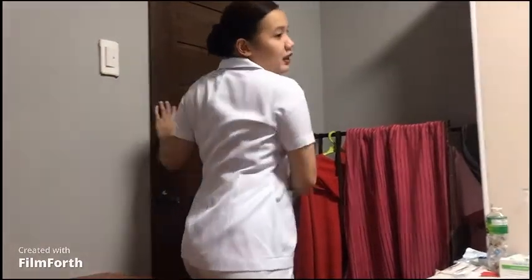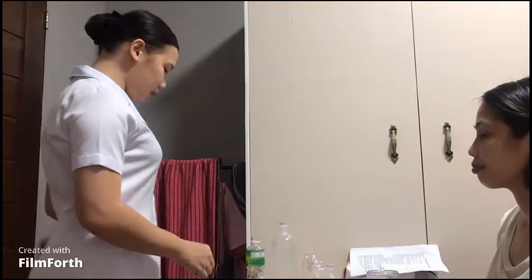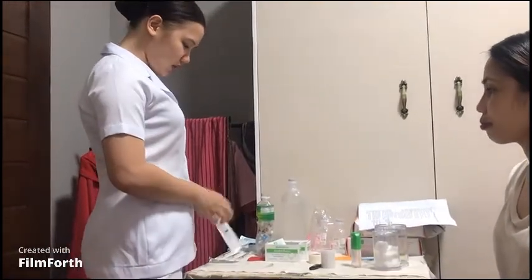Good morning, ma'am. I am Toni de Guzman from BSN 4, Broken Shark College. So let me prepare the medication first.